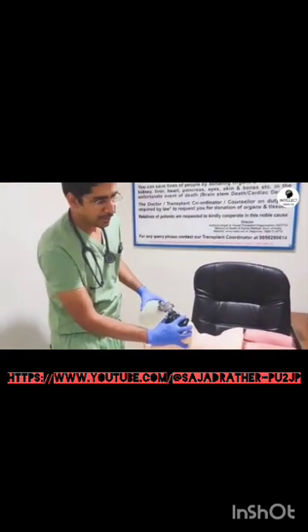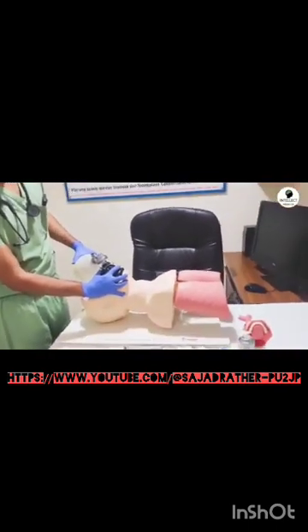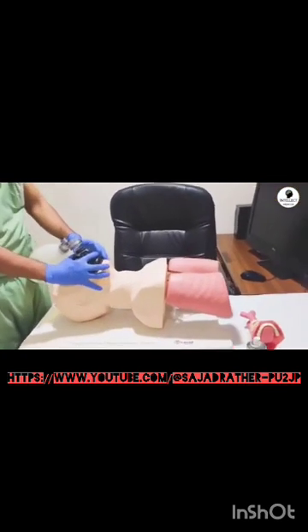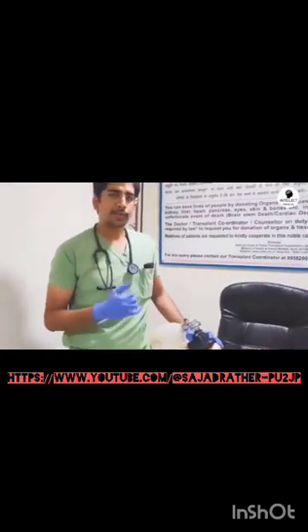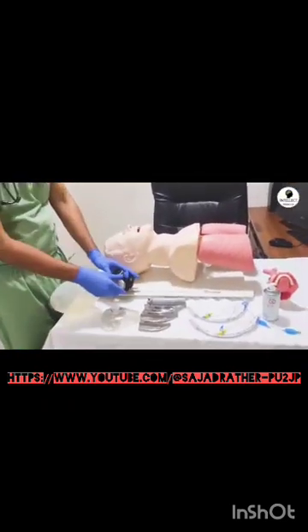You have to give the breath to the patient. As you can see, the lungs are inflating, right? So this is how you do a bag and mask procedure. Now, whenever you are giving medication to a patient, till the time the patient is anesthetized and relaxed, you need to give bag and mask ventilation. Now coming on to the other equipment.